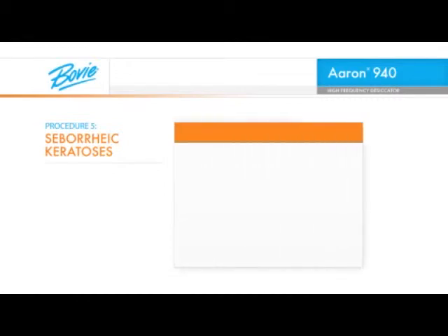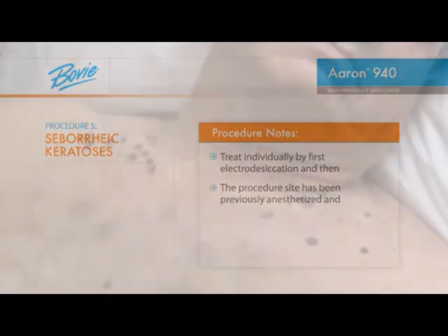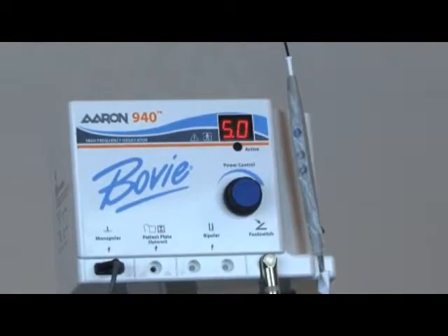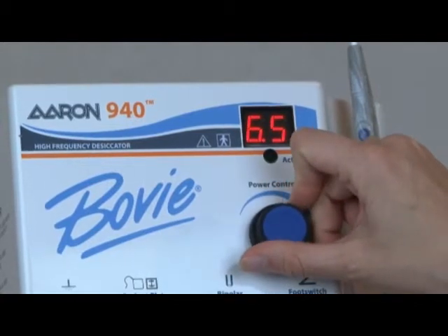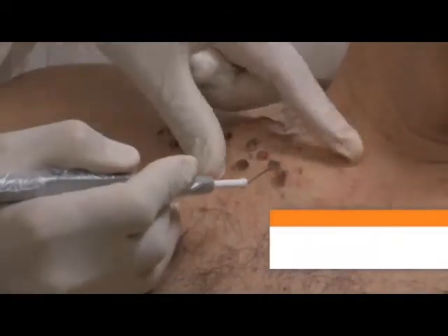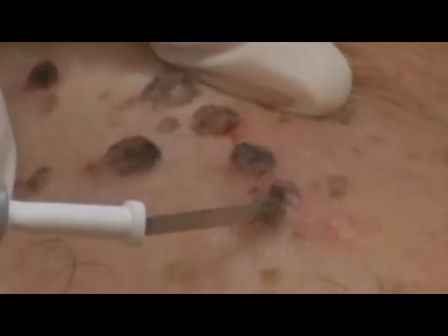Seborrheic keratosis lesions will be treated individually by first electro-desiccation and then curettage. The procedure site has been previously anesthetized and prepped. Some of the hyperpigmented lesions have been previously biopsied to make sure that they are benign before electro-desiccation. The BOVI A940 should be set at a relatively low power setting between 5 watts and 8 watts depending on the size and thickness of each epidermal lesion. A BOVI A805 sterile sharp dermal tip electrode is being used. For the larger lesions, use the side of the dermal tip to electro-desiccate a greater area of the lesion at one time.